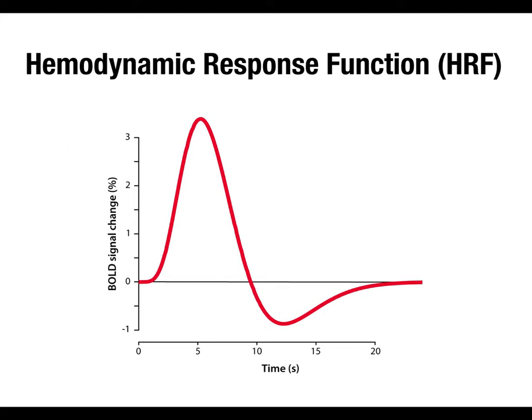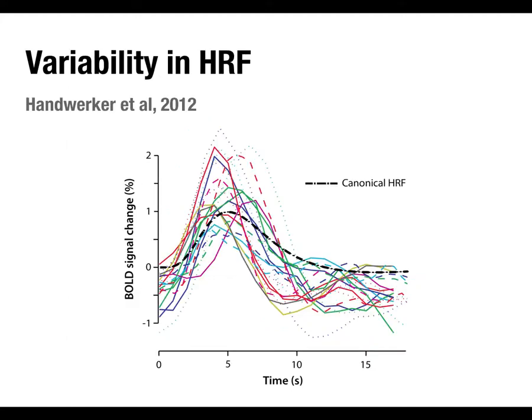And that's a huge limitation of fMRI, is it's very good at the spatial resolution, the where, but it's really terrible at the when question of when different areas are activated. And I'll come back to that. Actually, this sort of helps illustrate it.